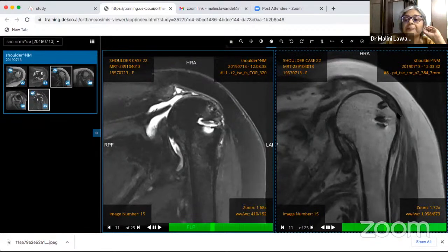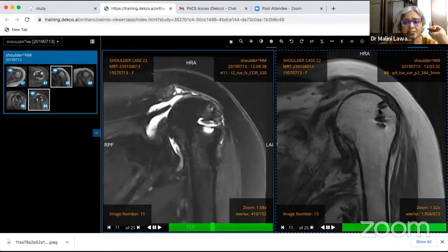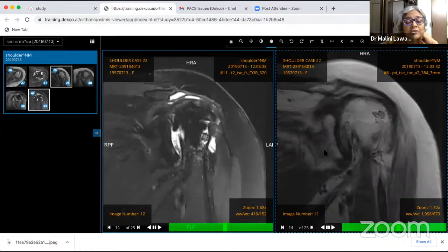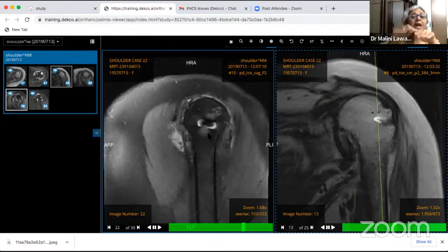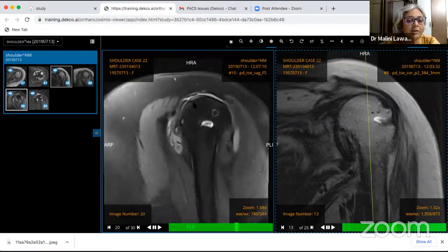So when you're looking for a re-tear, one, look for continuous tendon tissue going up to there. Don't look at its signal intensity. Even if it is a thickened, bright looking tissue, but going continuous, then it is fine. Here, there is a tear. We look at these anchors here; sometimes there can be migration, they can be dislodged, you can have osteolysis around them, sometimes you may have post-op infection. And also we should remember that when we are looking at post-op cases, on the sagittal images, even normally you may have some gap because the entire AP thickness may not be repaired. So there could still be some AP gap, but if for the majority of the tendon you can see continuous tendon tissue, it is fine. In this patient here, there is a re-tear of the tendon.